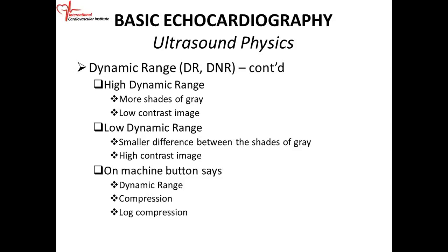The temporal resolution is very important. Remember, that's also going to be at the side of the machine. Usually when you're facing the machine it's on the right side, but they can put it on any side they want. When you are using the machine, you have to know everything that's on the machine.